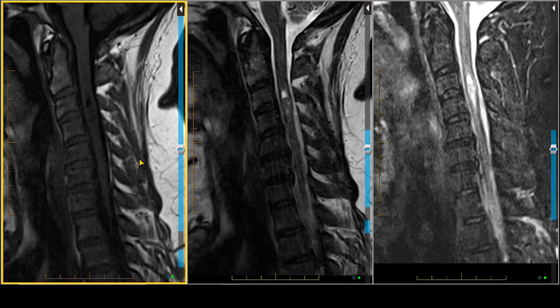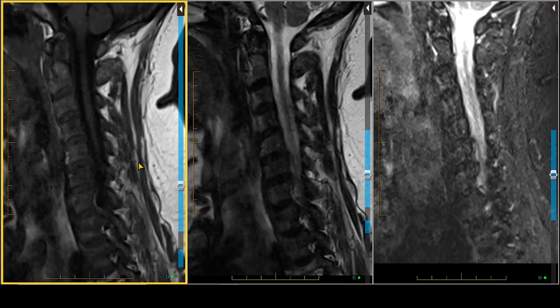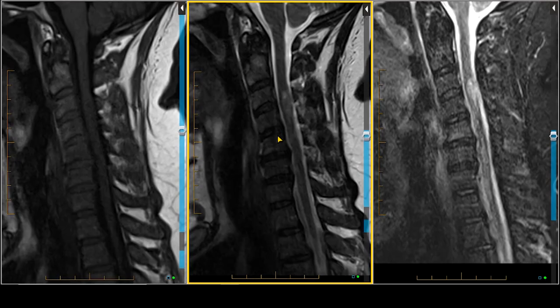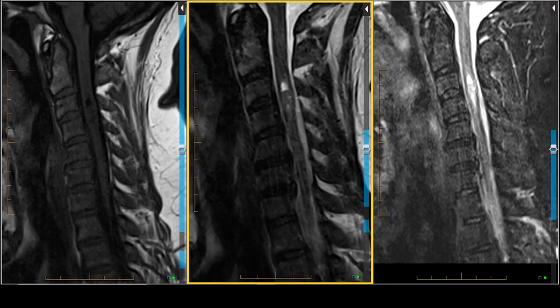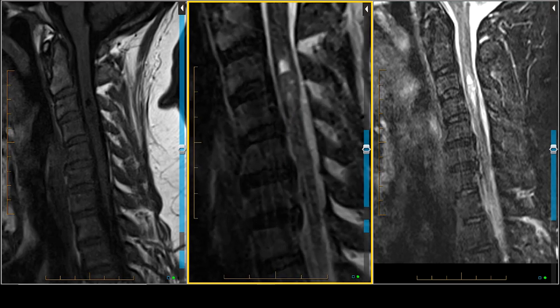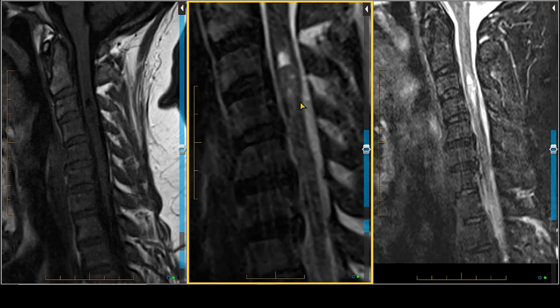We can do a little bit better with the next lesion. In this case, we again have a cervical spine lesion, and we see that the lesion has both a cystic as well as a solid portion to it. As I magnify this one image, you might ask the question: is it truly cystic, or is that just cord edema?